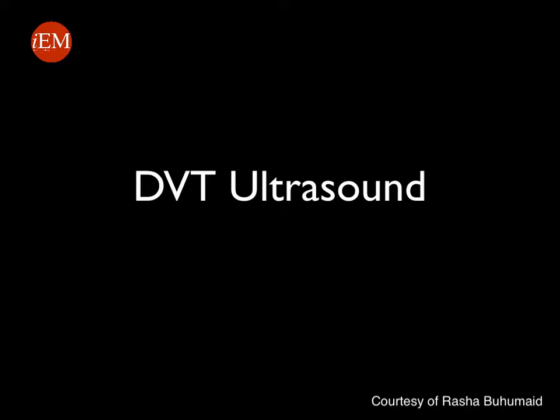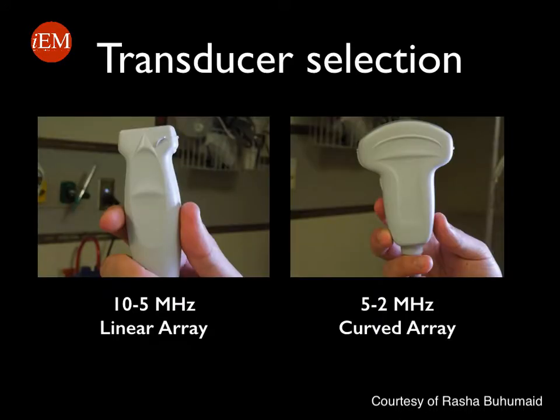In this tutorial we will be reviewing the two-zone technique to evaluate for deep venous thrombosis. The transducer you will use to perform the study is most commonly the linear or vascular probe. You will rarely need to use the curved probe, especially in obese patients where you need to image deeper structures that might not be visualized using the linear probe.